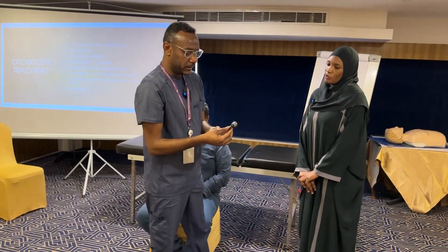No worries. Please concentrate with me. I'm going to teach you how to use the otoscope and assess the ear. If you have any questions, please feel free to ask me immediately. At the end, I'm going to give you some lectures and online resources for further studying, and I will be glad to meet you again for further discussion. Is that okay? First of all, I will show you the parts of the otoscope.